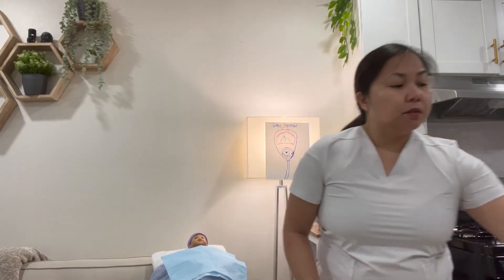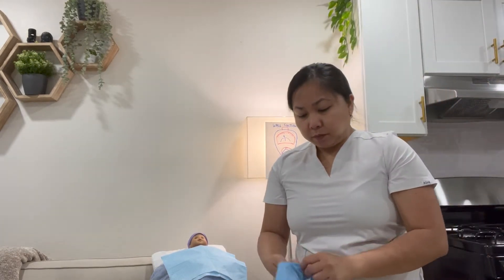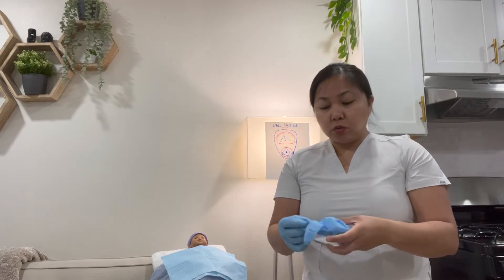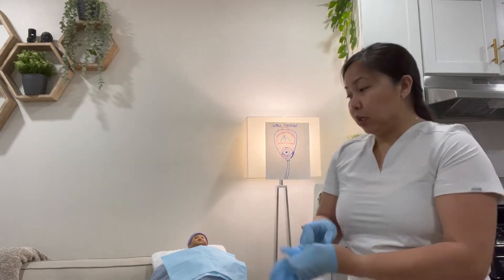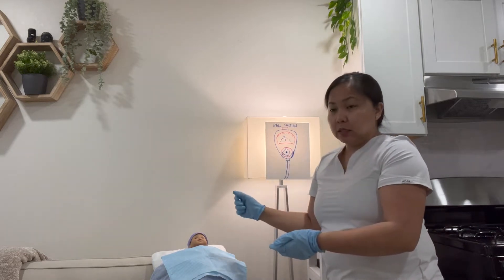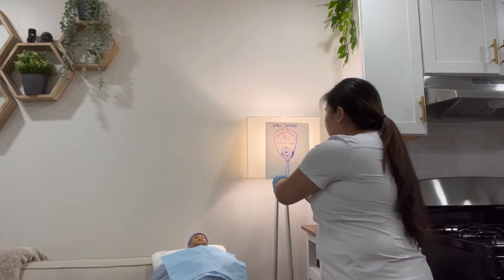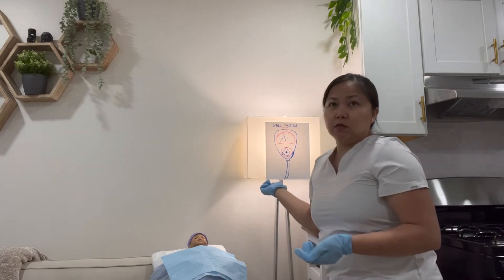Put on disposable gloves, then occlude the suction tubing to check that it's working. In this case it's a neonate, so I'll set it to 60 to 80 mmHg, then occlude the tubing to verify suction is functioning.